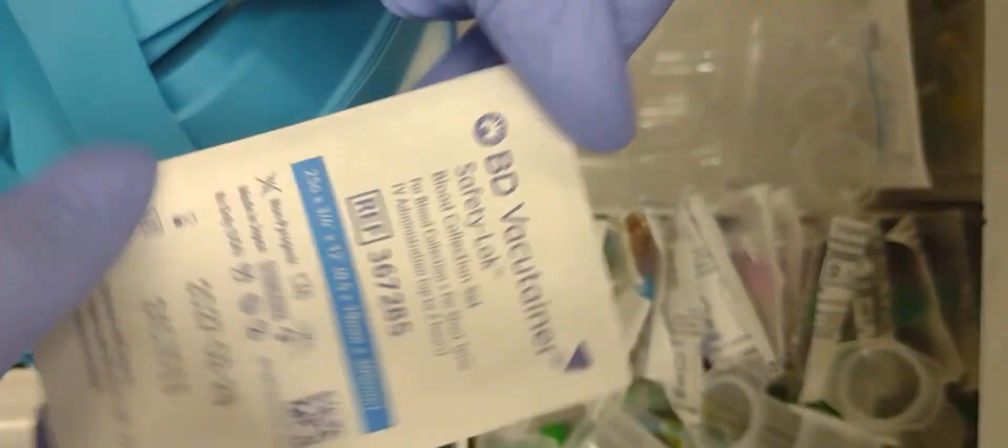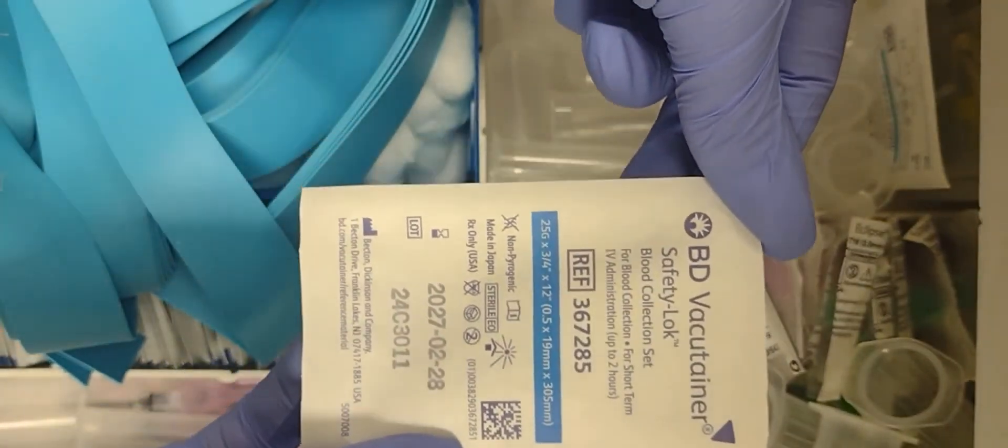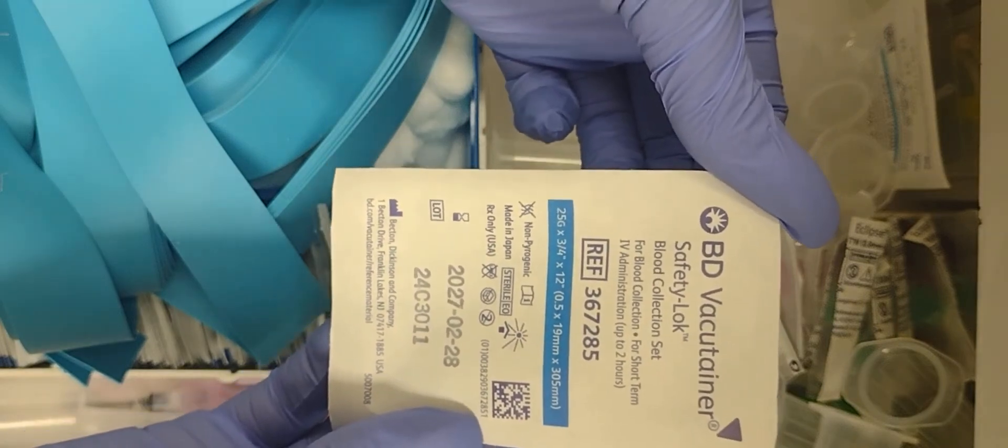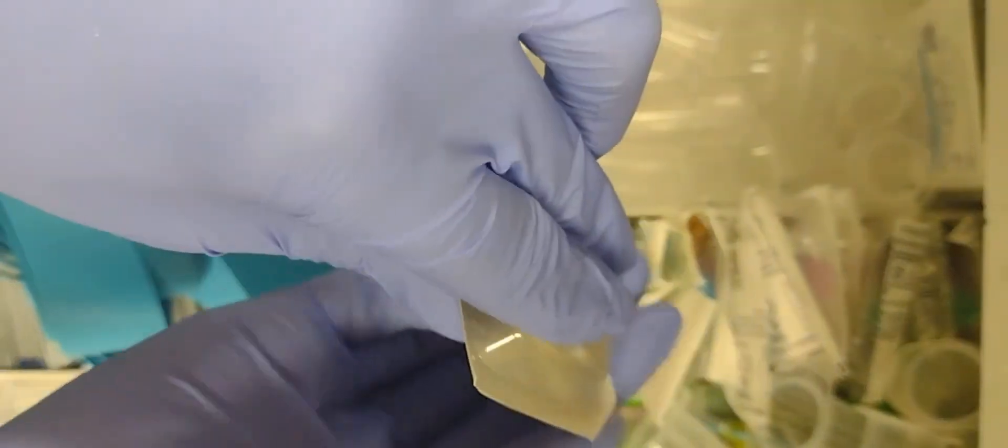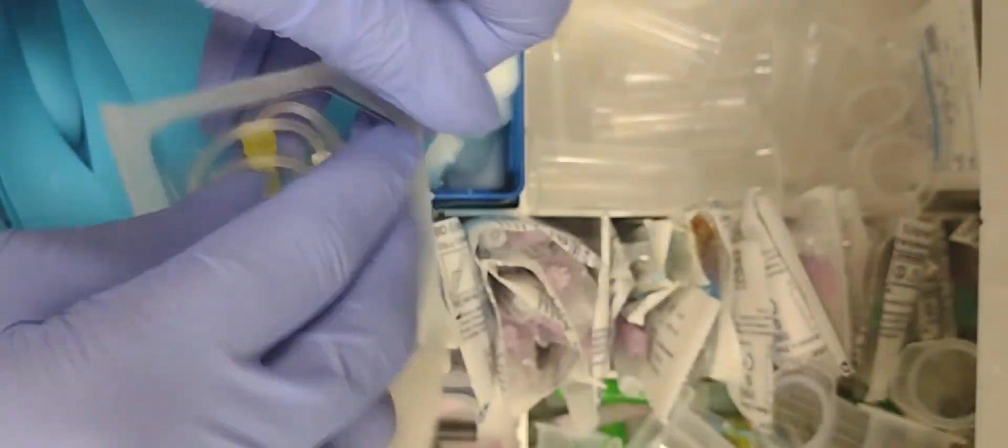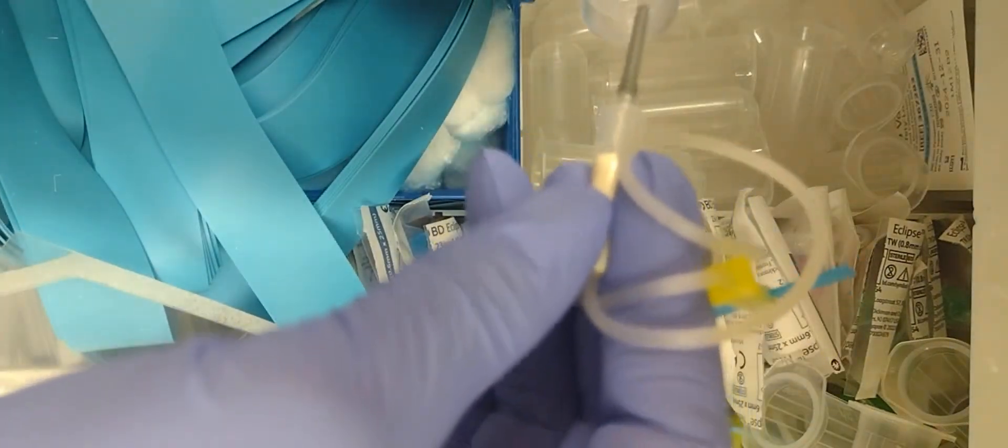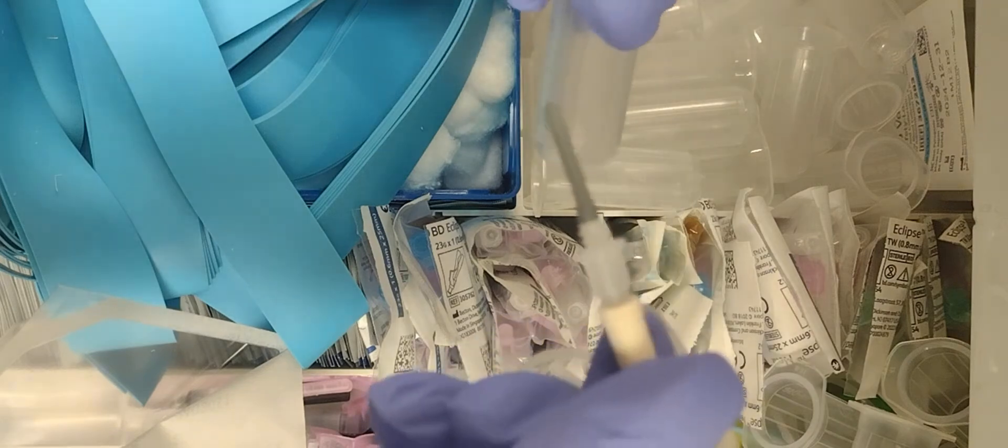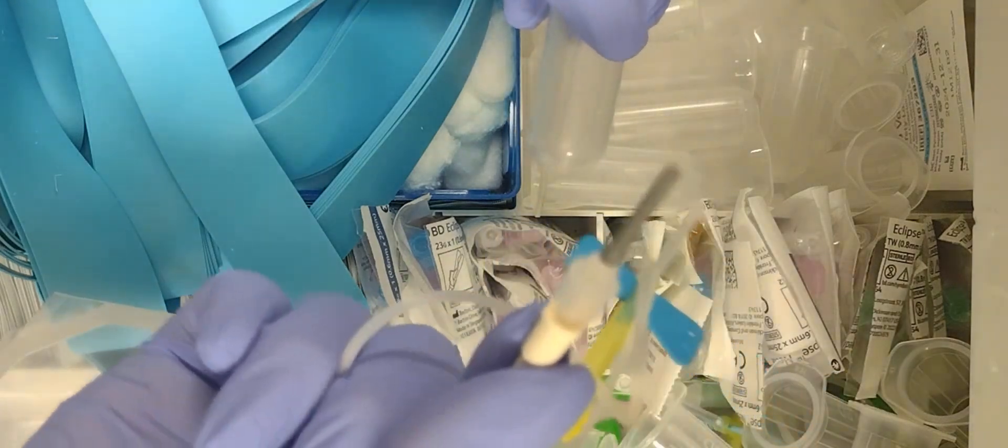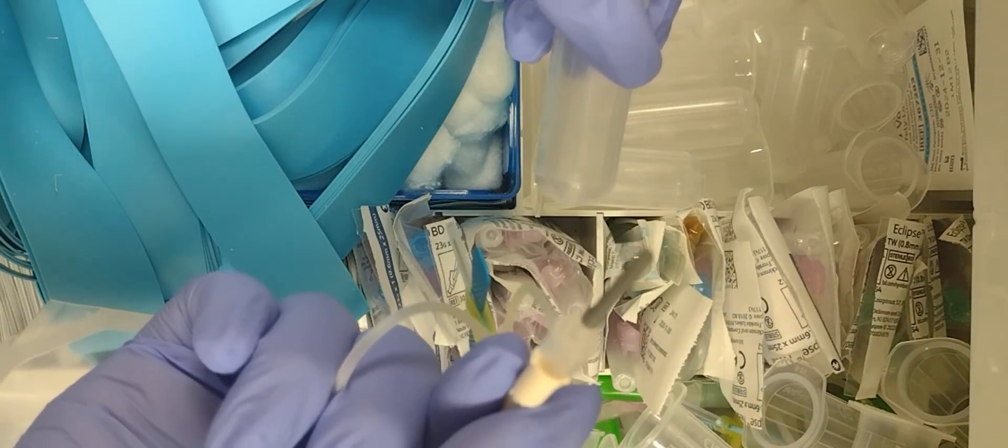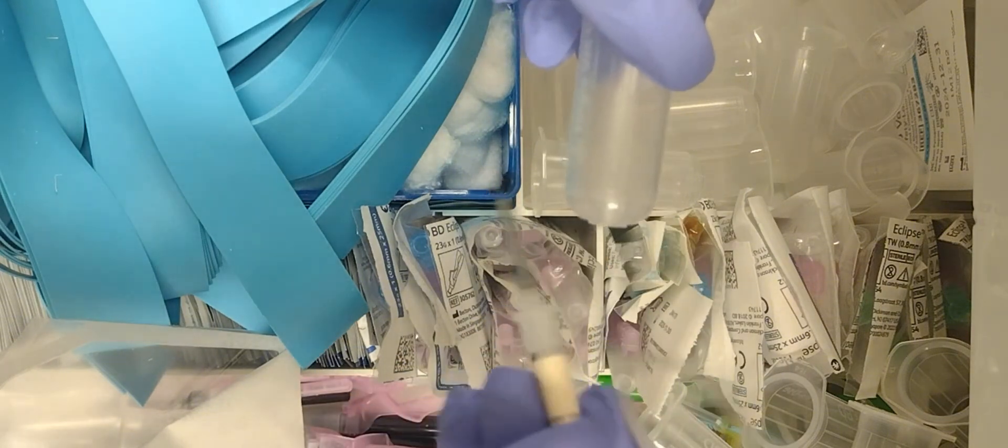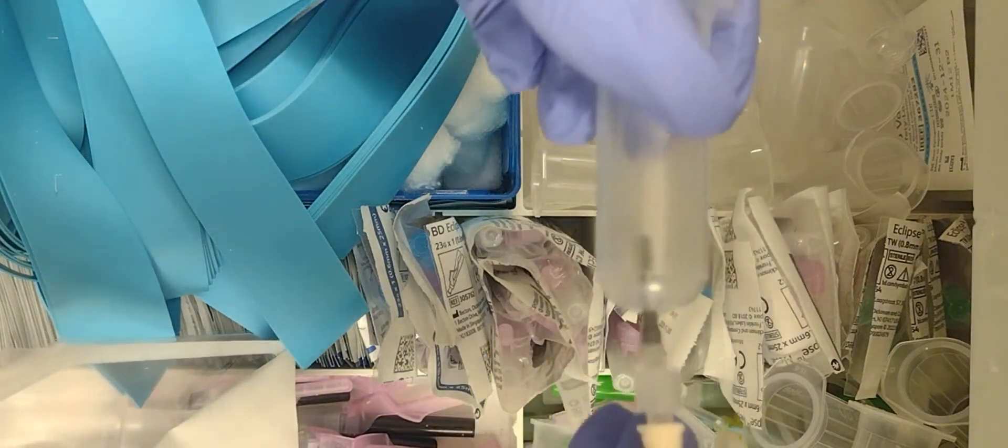All right, next we're going to do a 25 gauge butterfly vacutainer needle. So here's the hood. Once again, here's the needle that's going to be attached to the hood. So what are you doing? Just twisting it on.